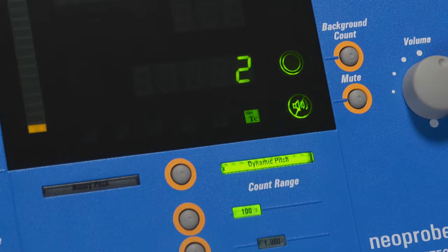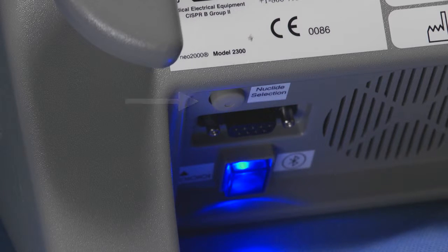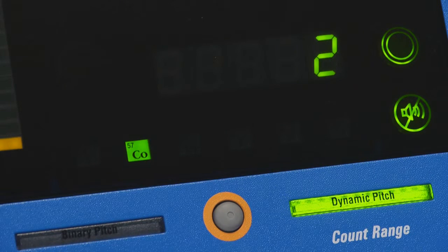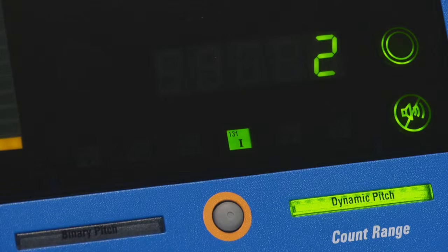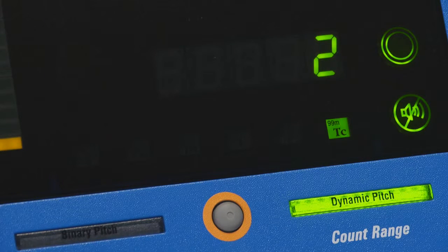To change the radionuclide, push the Nuclide Selector button located at the rear of the unit. The system will cycle through the available radionuclides: I-125, Cobalt-57, Indium-111, I-131, F-18, and then back to Technetium-99.